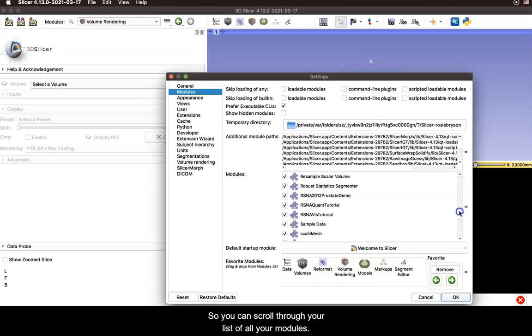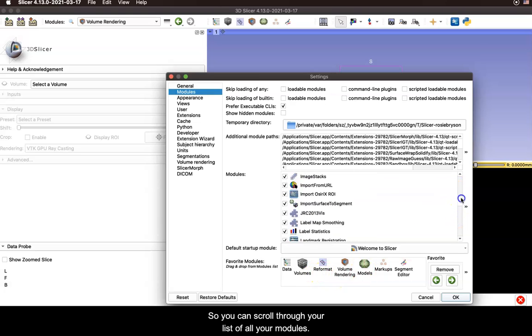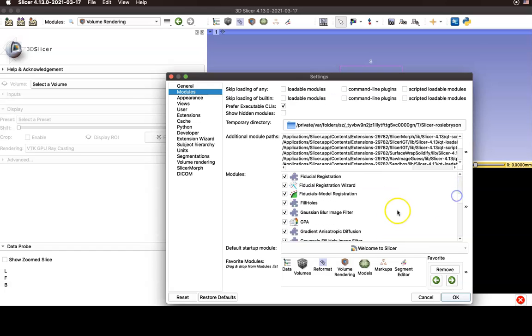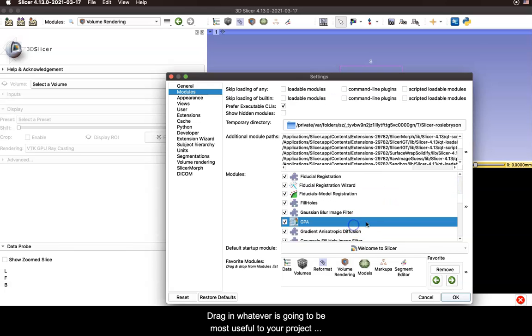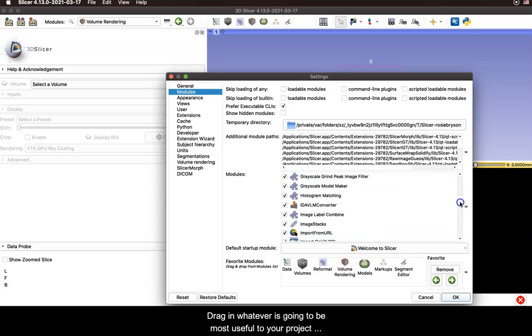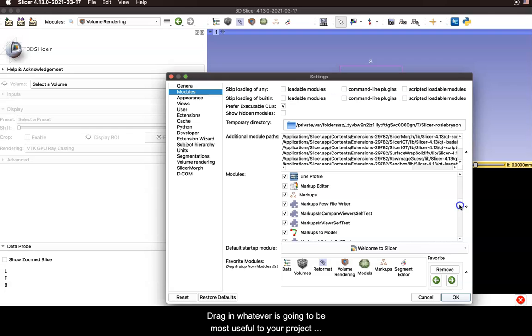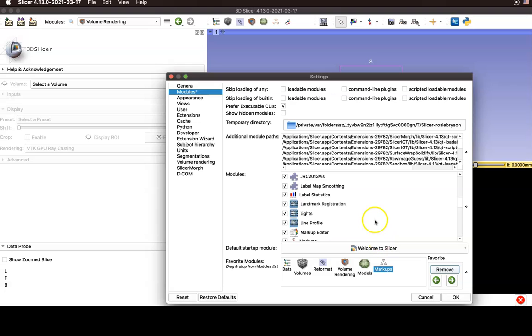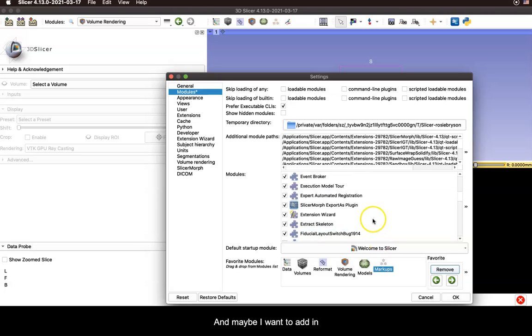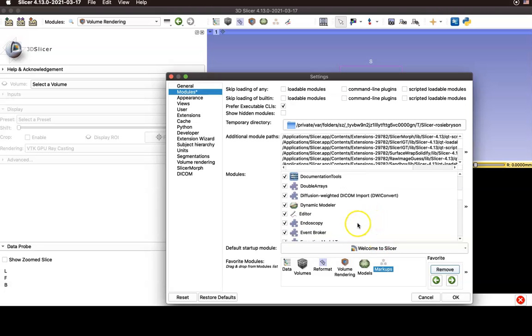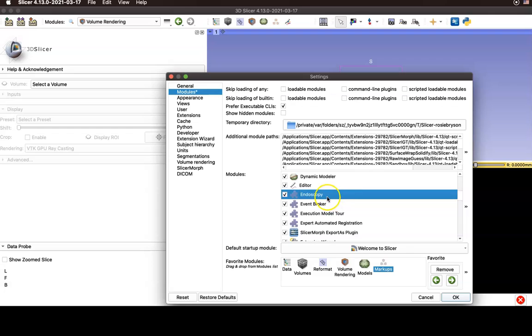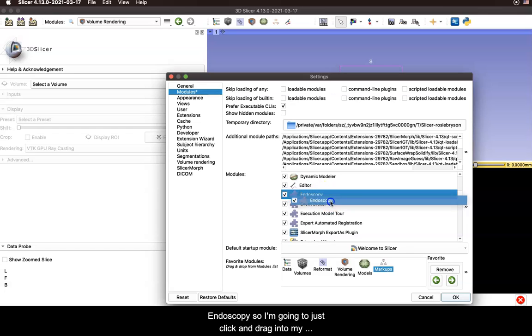So you can scroll through your list of all your modules and drag in whatever is going to be most useful to your project. So you can remove options like remove segment editor and maybe I want to add in endoscopy.